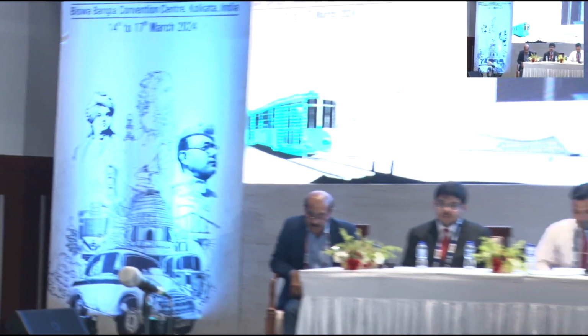Do you do endoscopic vitrectomy for patients who get chronic hypotony following a VR surgery? We are doing it now for some of our uveitic eyes and eyes which have chronic hypotony. It gives us a much better way of assessing those peripheral ciliary body membranes and trying to truncate and remove them. So we have started doing them for our uveitic eyes and eyes with persisting hypotony.